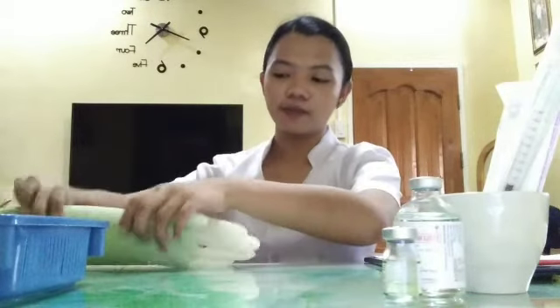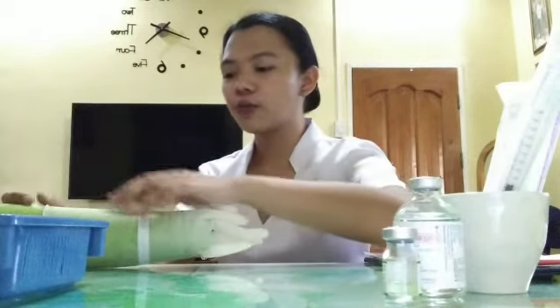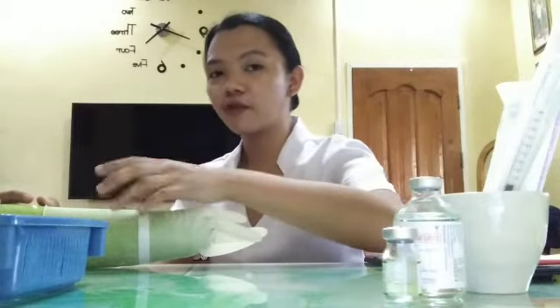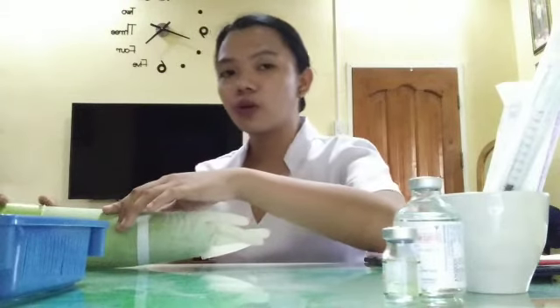So after that, we will locate the site where we will be putting the injection. So we will check if the site is free from edema or any scratches, wounds.